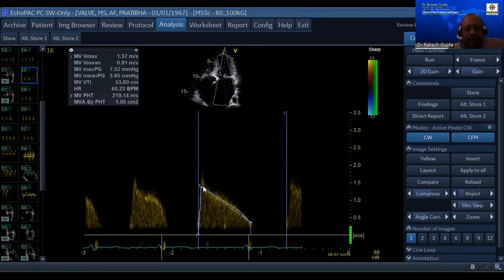Yes, if it's atrial fibrillation, we do not have an A wave. So we'll trace the Doppler spectrum pattern, minimum 5 readings, and we'll take at least 5 readings. What will we do with this reading? From where will we measure this? Next person after Dr. Swapnil, there is Dr. Rahul Kenkan.